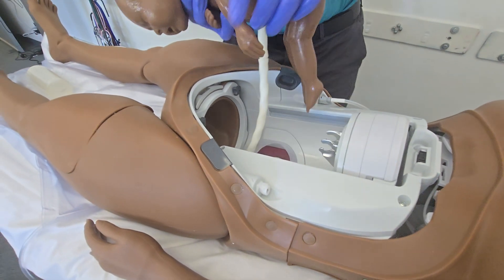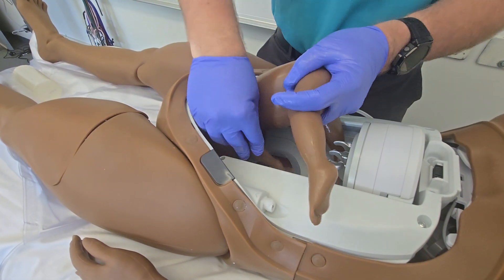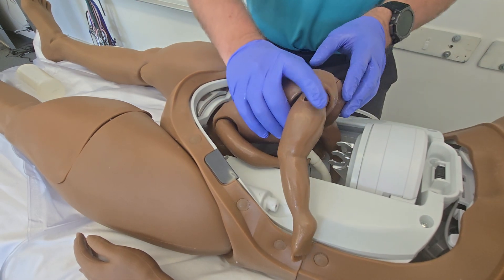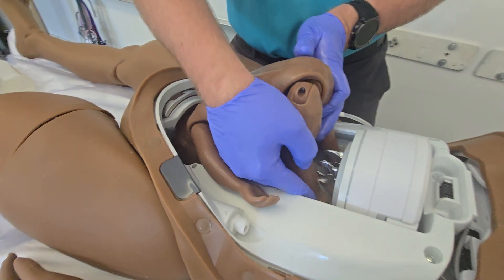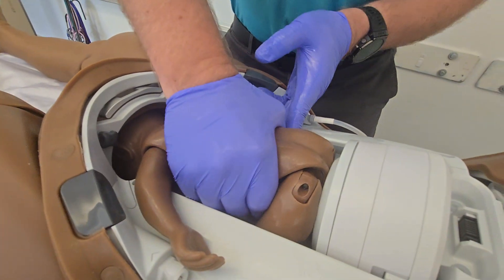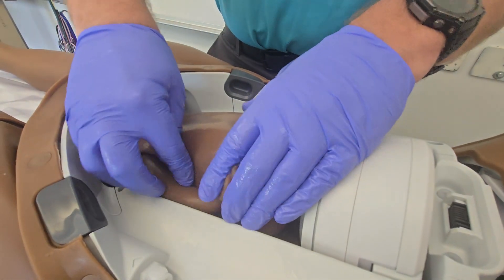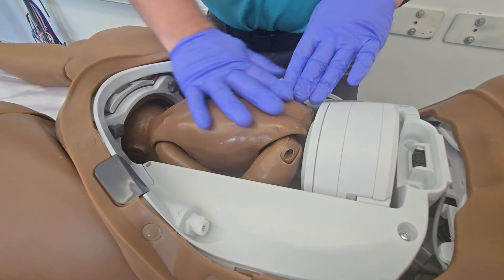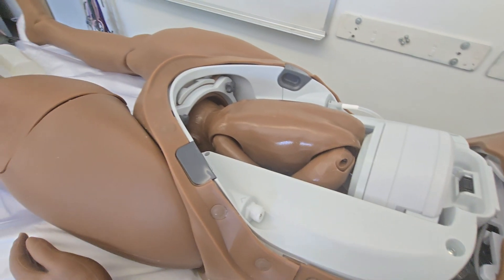Now we're going to go head first for delivery setup. We're going to cross these arms as best as we can — this is where the clamp actually attaches. Your legs are going to tuck into that scoop we saw earlier on the delivery module, and you should see that locks in like so. We'll tuck that in as best we can, loop up the back, then put the belly module back on and we should be good to go.